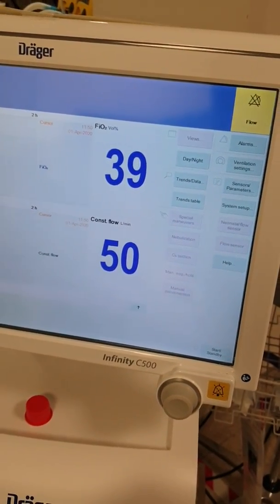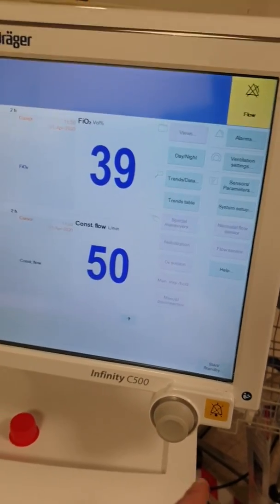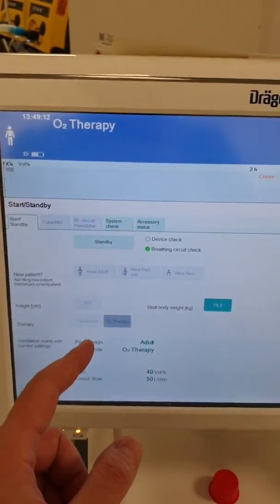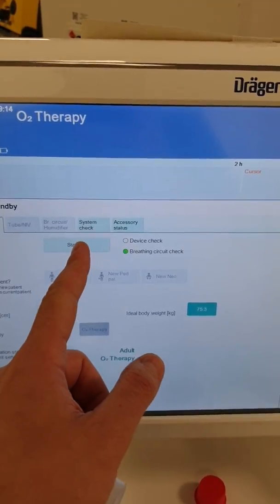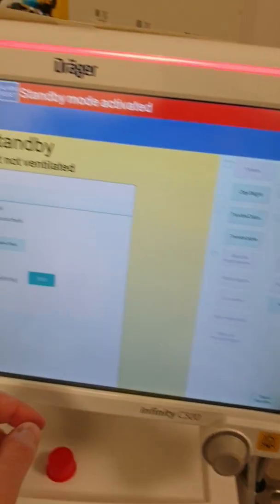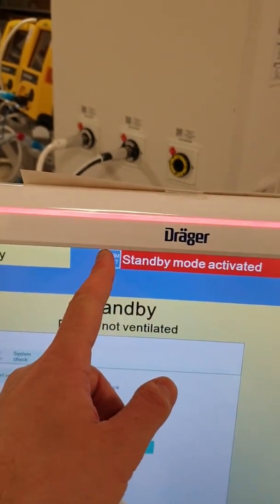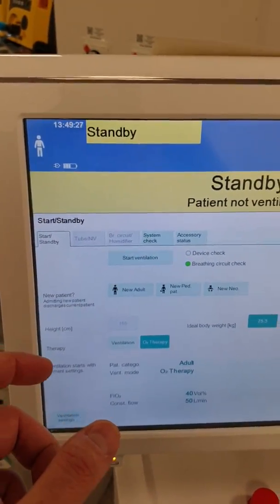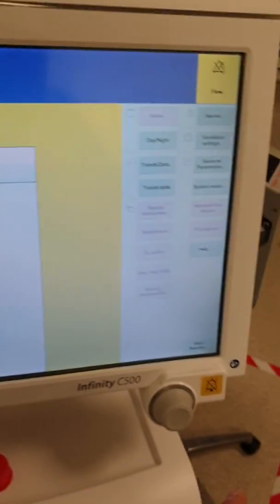To go back to normal mode of ventilation, we're going to press standby, put it on standby, and confirm. We're in standby mode and we'll just reset the alarm. You can notice that every change on the ventilator needs to be confirmed by pressing the knob.